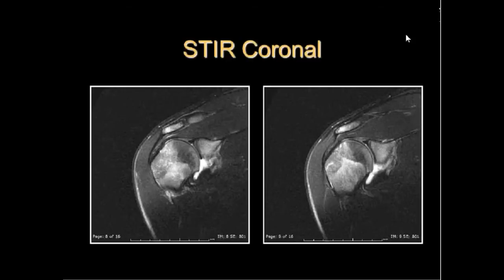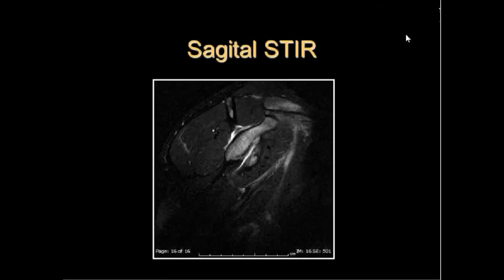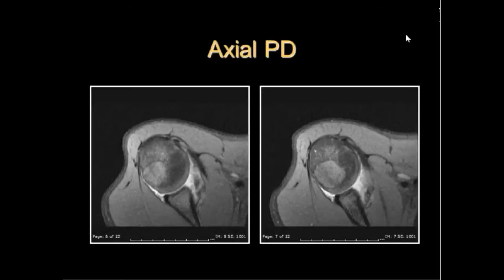On the axial images, you really don't visualize the anterior labrum. You have some kind of amalgam of tissue here, which is probably partly anterior labrum and periosteum. This is a Hill-Sachs deformity and anterior labral tear, or a Bankart lesion.